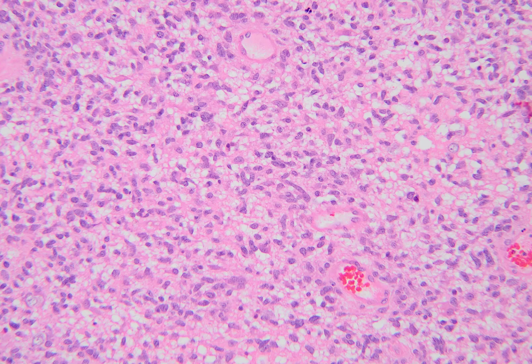Now let's turn our attention to the histology. The tumor is hypercellular and composed of a pleomorphic population of cells with elongated and irregular nuclei. The tumor cells blend in with the brain tissue with no evidence of a circumscribed border. These are features of an infiltrating glioma. Metastatic tumors characteristically have a sharp border that separates the malignant cells from the surrounding gliotic brain tissue.